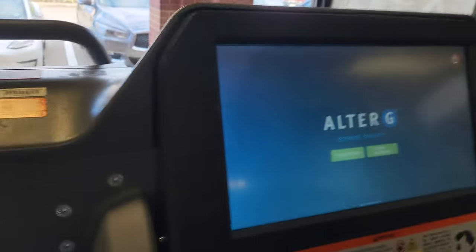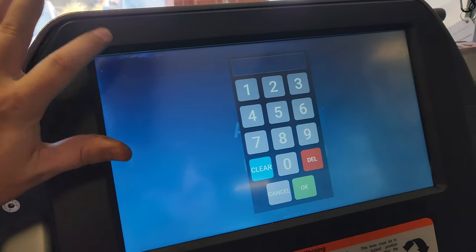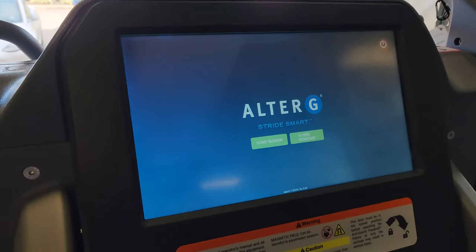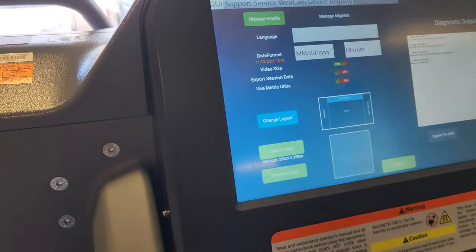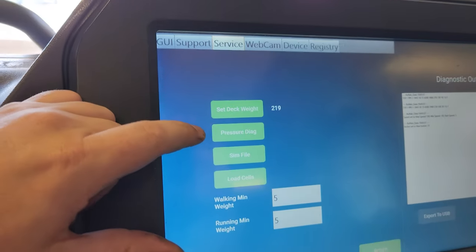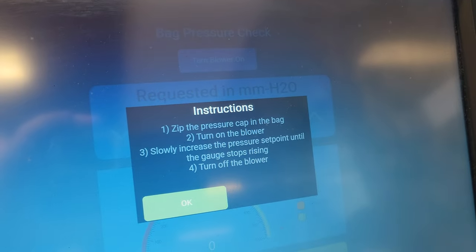When you get to the main screen, there is a spot up in the corner — you tap it a couple of times, put in the secret code, and then it will go into a setup screen where you can set it up however you like. I can come in here to service and one of the cool things is I can set pressure diagnostics. So it's asking for the bag to be zipped up to close this off, because it has to be closed in order for it to measure pressure.